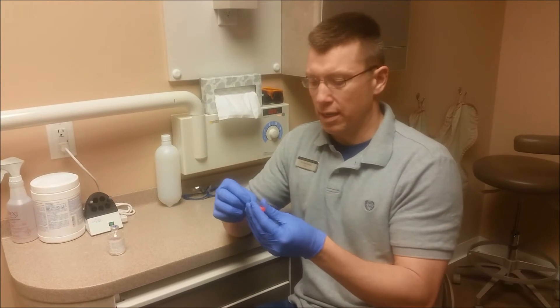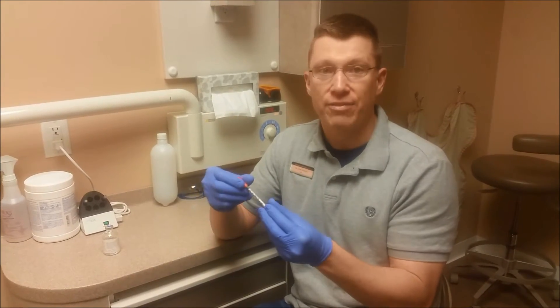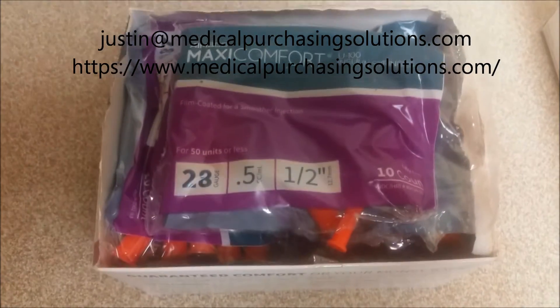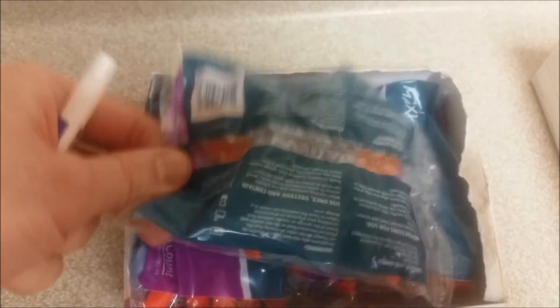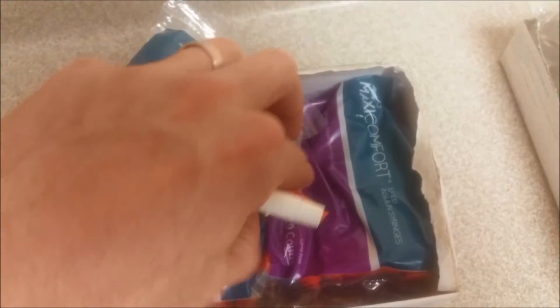I also bought needles — they're just insulin needles — and this is a half cc. Right here you'll see that I have a half cc. This is just what I was using to inject that.